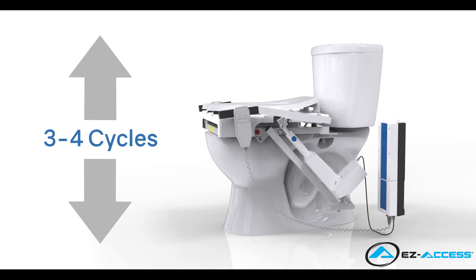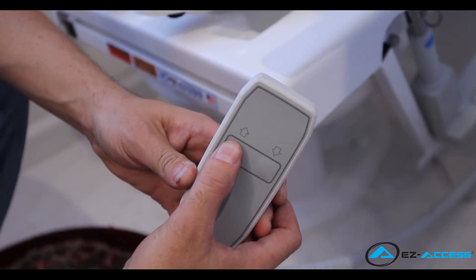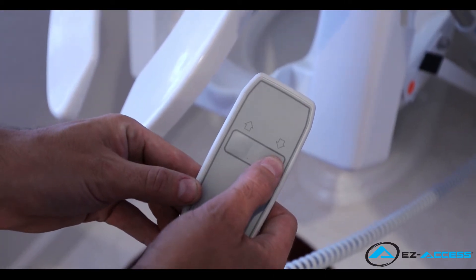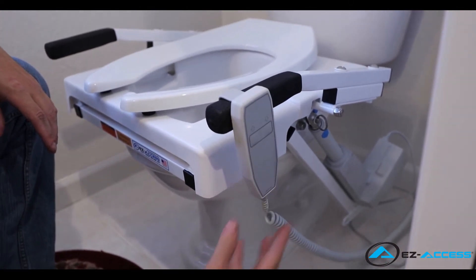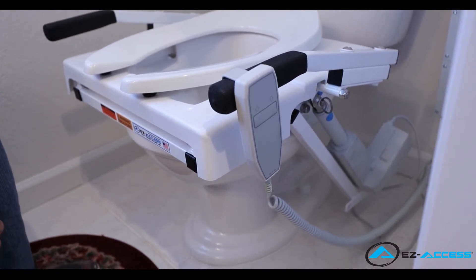In order to test cycle the tilt before use, raise and lower it three to four times without sitting on the seat. To raise the tilt, push and hold the up button. To lower the tilt, push and hold the down button. For convenient storage and access, hang the handheld control onto the tilt handle nearest the battery and actuator. Make sure to route the cord in a manner that is convenient and non-hazardous to the user.